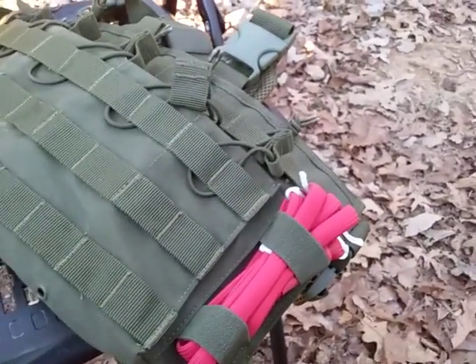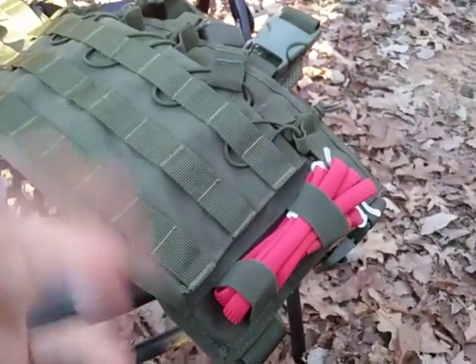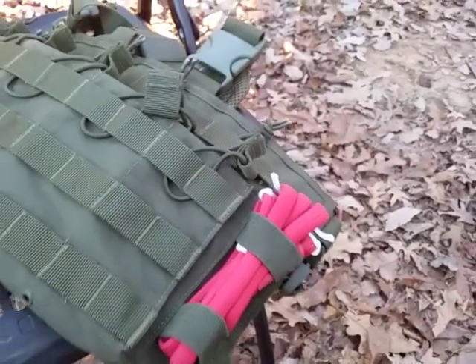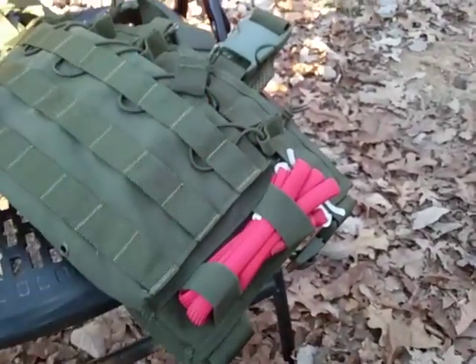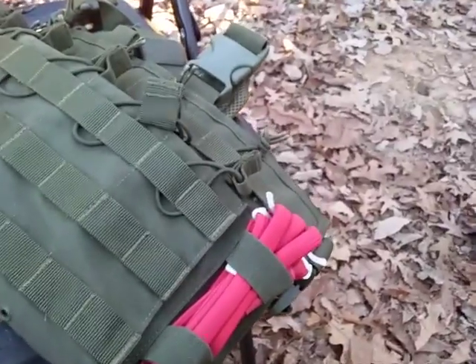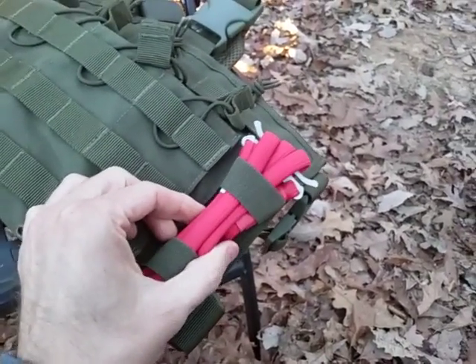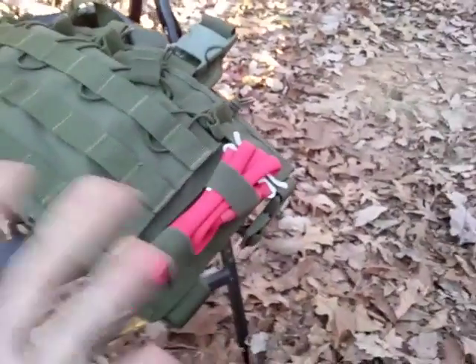And then, of course, they have the SOF-T. SOF-T Wide, and I don't know if they call it narrow, but the standard width, I think, is 1 inch, and the wide is 1.5 inch. Now, the SOF-T Wide, in my opinion, is another option to go to. It's probably the gold standard, what you'd say is the ultimate tourniquet on the market commercially. If you're looking for the best of the best, you're definitely going to pay for that. You can get maybe 3 of these RATS tourniquets for the price of one SOF-T Wide. But it is worth it.